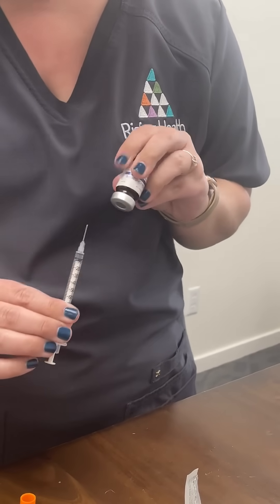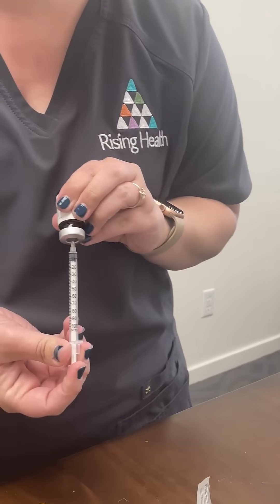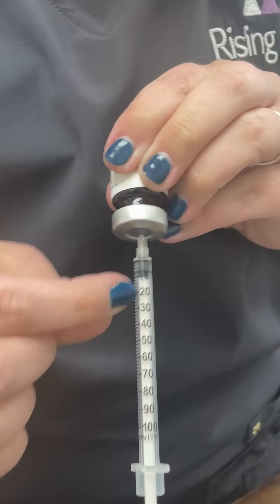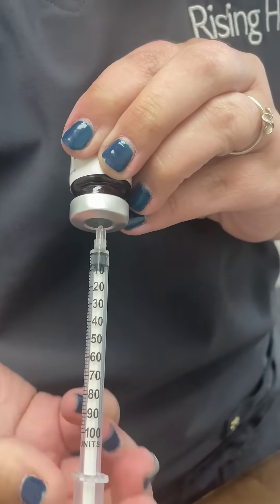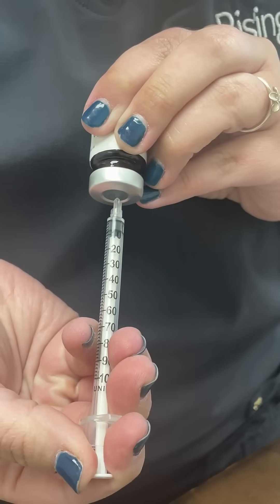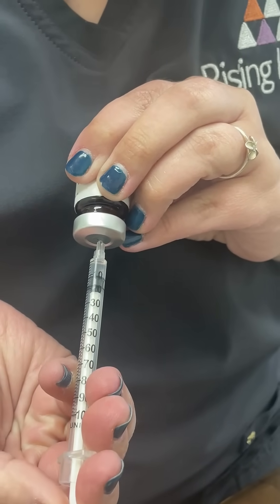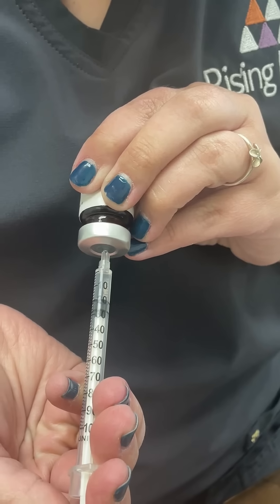Turn it upside down, stick the syringe in, and then depending on your units, you'll follow this — it just matches exactly what your units are. So for 10 units, you'll pull to 10; for 20, to 20, and so on.